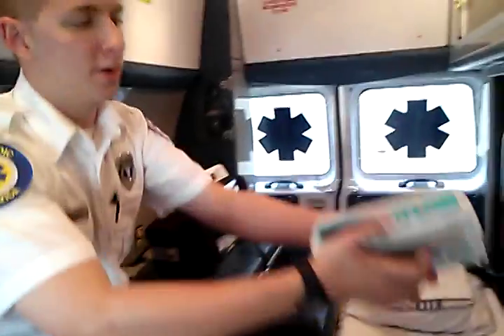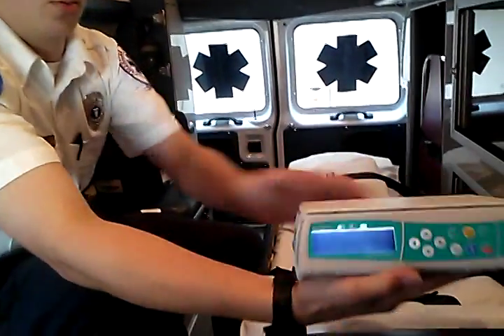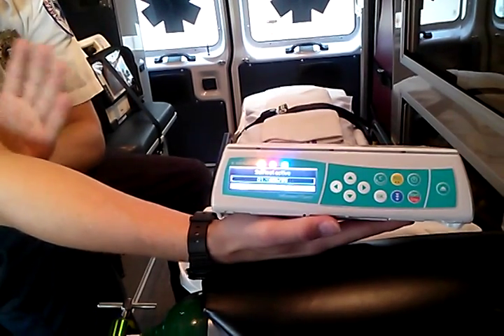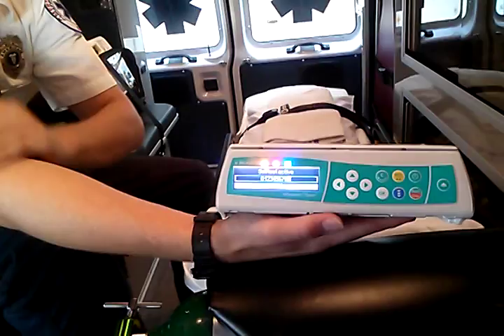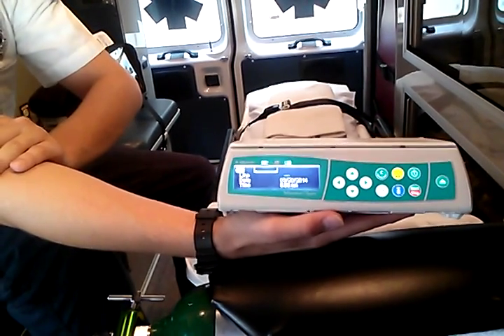First things first — when you get your pump, you're going to press the power button to turn it on. Once you load it up, it's going to run through a quick self-test, which is going to take about 10 to 15 seconds or so. Let it run through the self-test and wait for it to be done before you put any settings in.